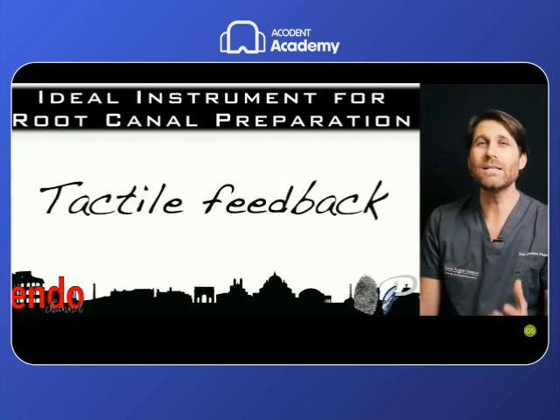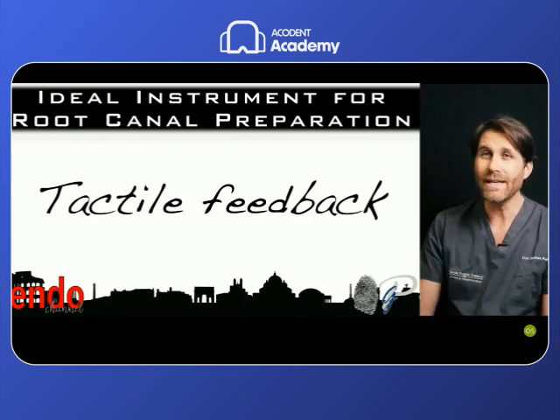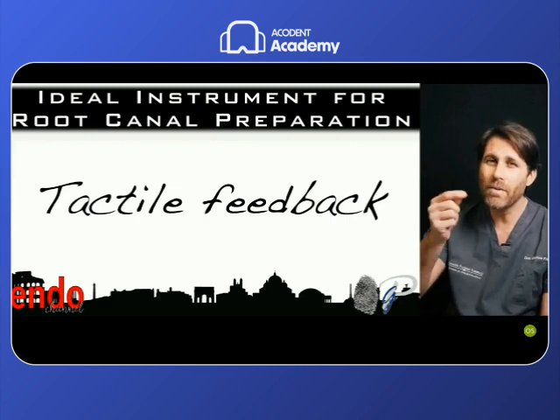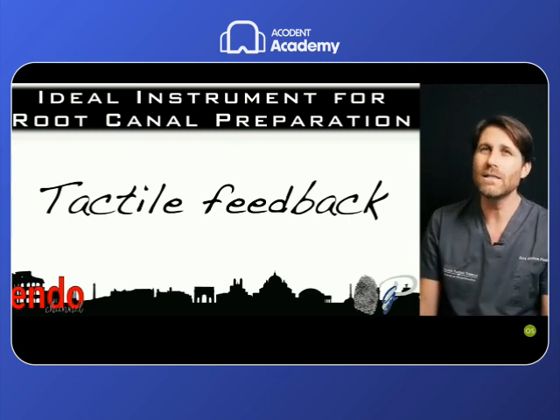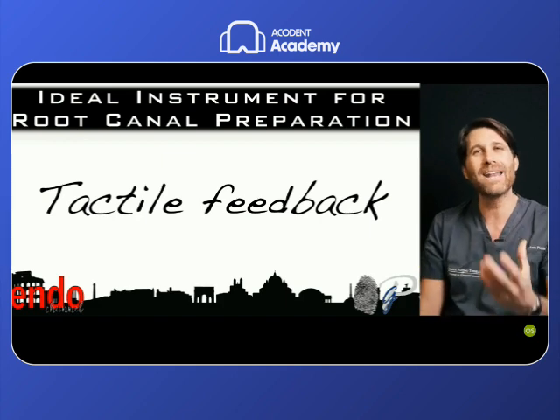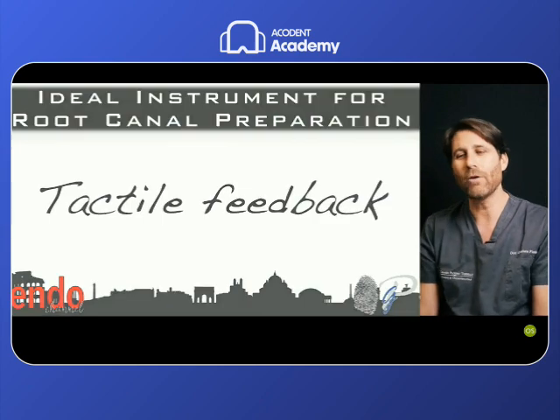I have used these terms. It's like a probe that is activated mechanically. So it's like an extension of your hand, like an extension of your fingers. When you use a probe, you have the tactile feedback of what you are touching. You find the orifice, you find the canal. So with this instrument, you are using it like a probe, you find the orifice, then you activate, and you have a mechanical probe, very efficient and flexible, that permits you to scout these root canals.